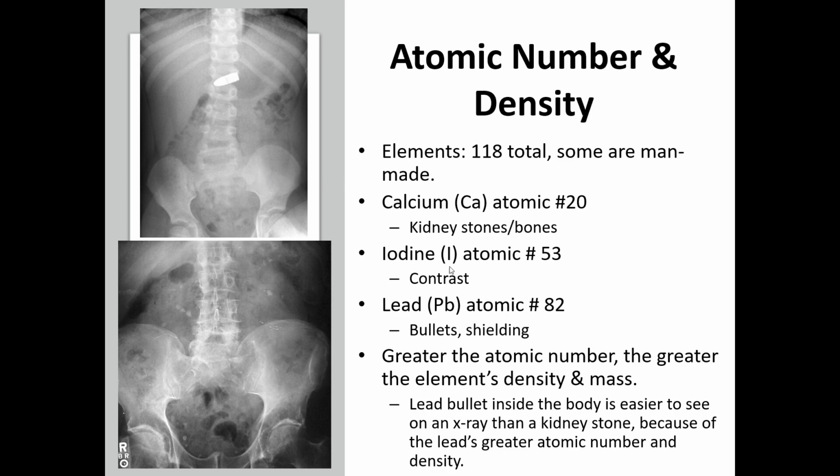And then we'll talk a little bit about how atomic number relates to density for structures. We have some x-rays over here of the abdomen. Unfortunately, I know we don't x-ray abdomens as LPTs, but they generally produce some of the most interesting x-rays.